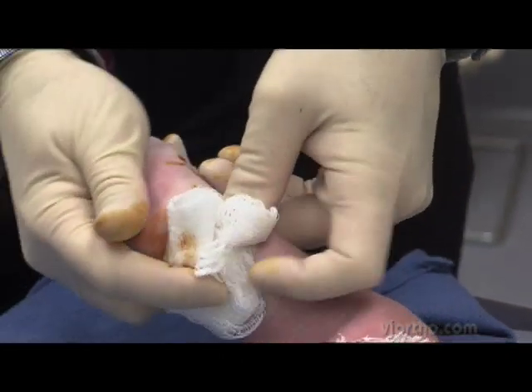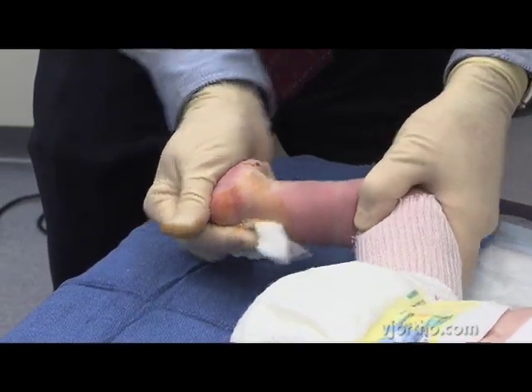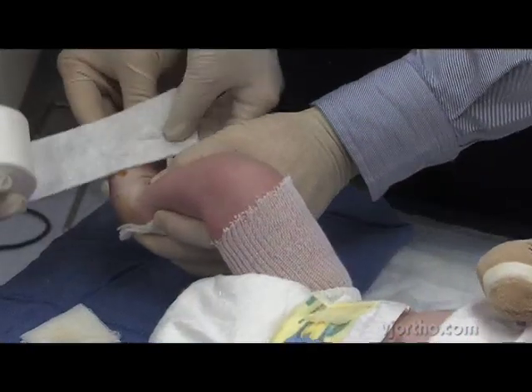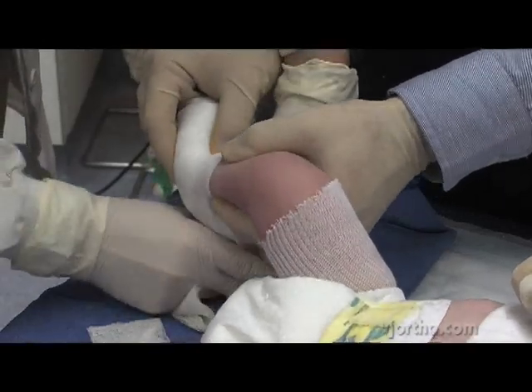I like to put pressure and then range the ankle. Look at the amount of dorsiflexion you can appreciate now in this ankle. Now we would go to applying the cast — we're going to put our dressing on and proceed with cast application.